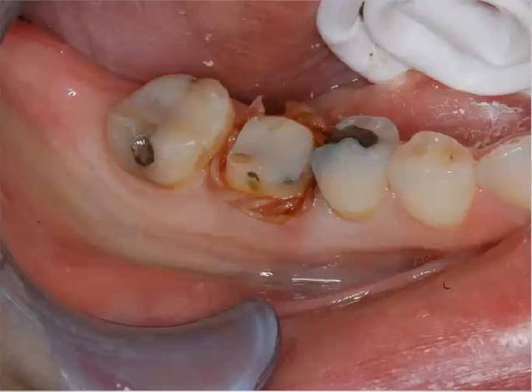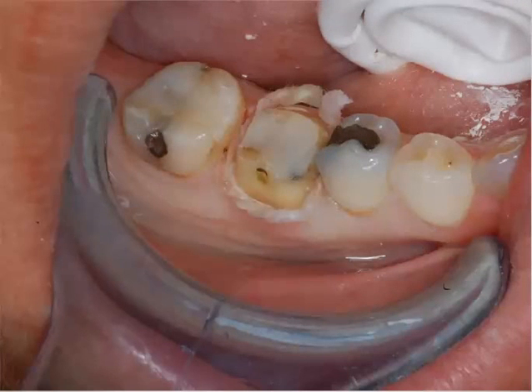When you have something like this where you have limited oozing, it's not of great depth, you can simply take this number 2 cord. It's saturated completely with that Hemodent. Leave it in there for 2 minutes. You'll find out once that's done, you can lift that off, rinse that off, and you'll now have initial displacement of the tissue, distension. Now you can take your secondary cord, and this is the same cord.